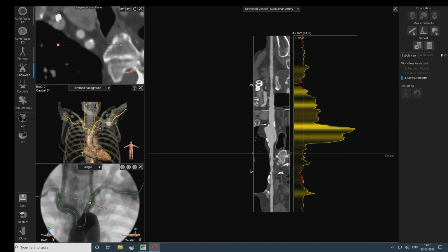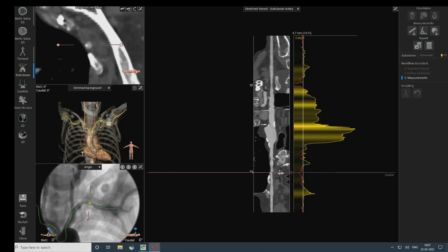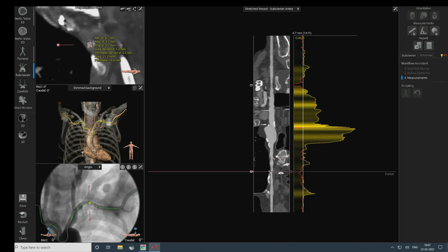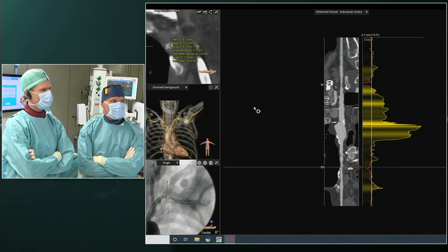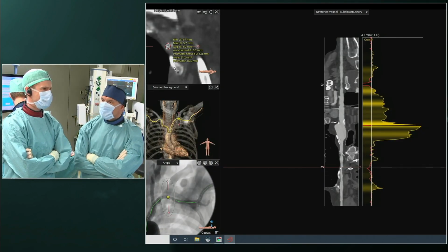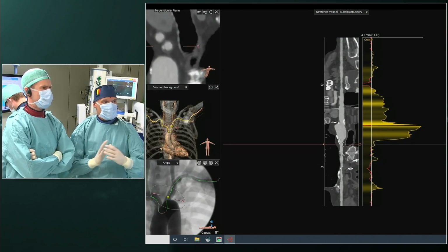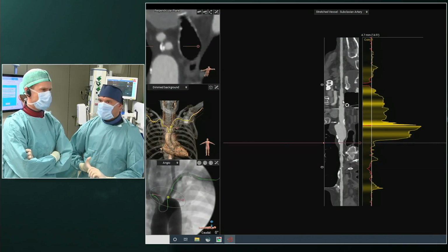On the left it's also not very large, with a minimal diameter of 4.7 millimeters, and there's the pacemaker located on the left side. That might complicate an axillary approach, and on top of that, the landing zones for a potential embolic protection device with filters are also suboptimal because of the atherosclerotic disease around the landing zone.